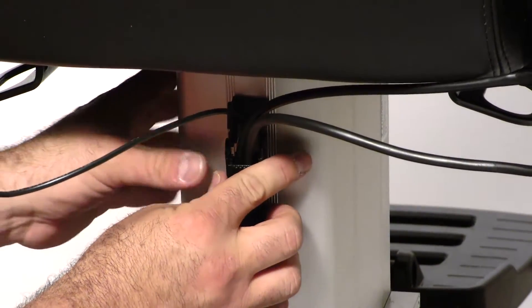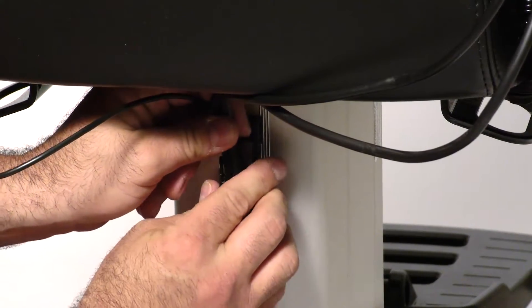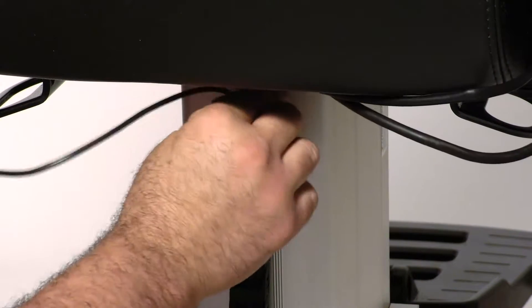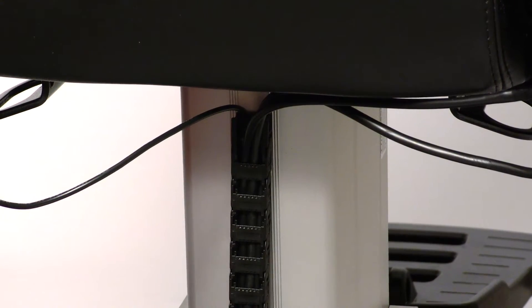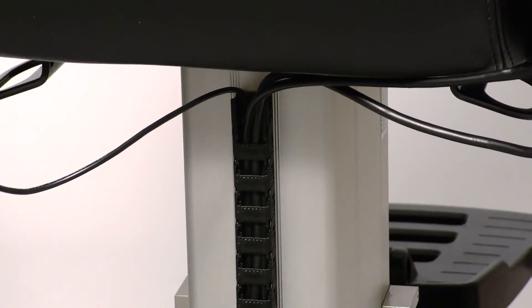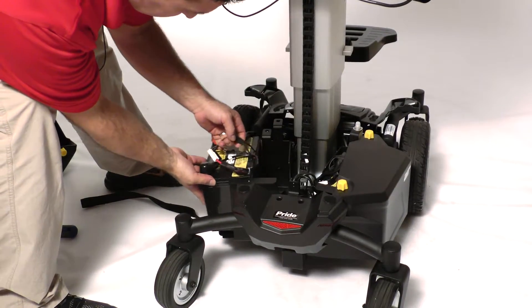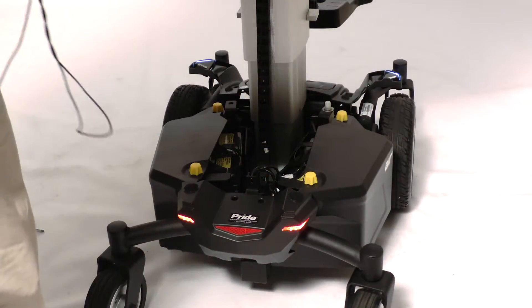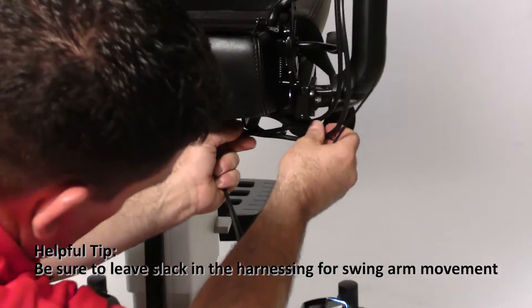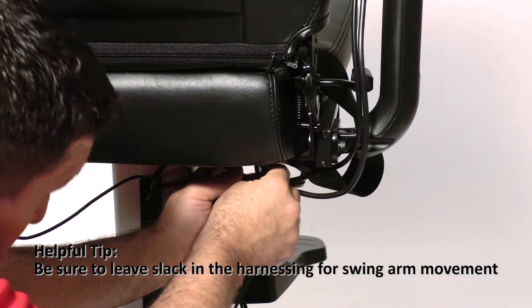Do the same with the top — just reattach it, making sure your harnessing is in the center. Now put your battery back in and reattach it. Finish securing your harnessing to keep it out of any pinch points.